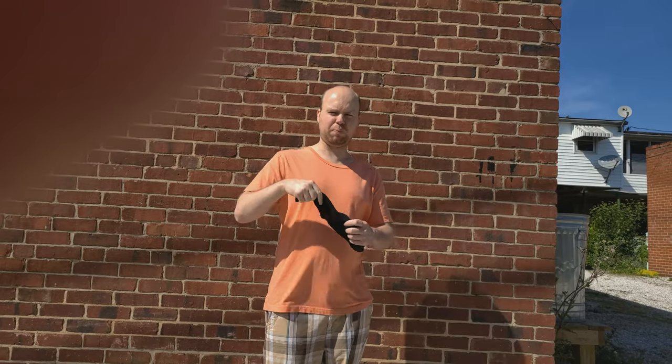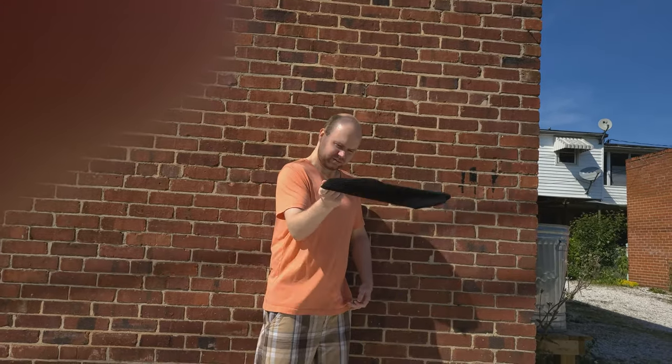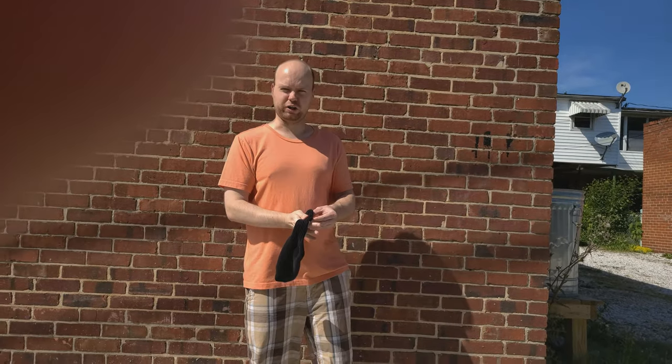All right, so again, the key to this is you have to whip it around really fast. So again, this is normal motion. And you just have to do it for like five seconds. And then I'll show you a close-up.